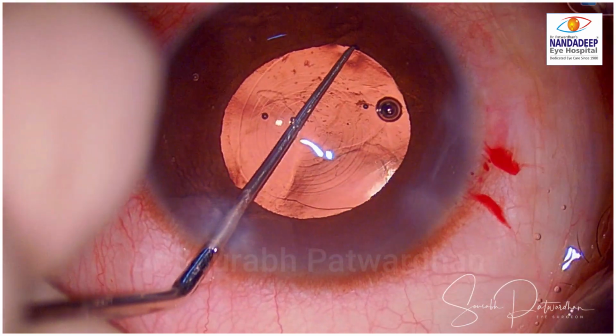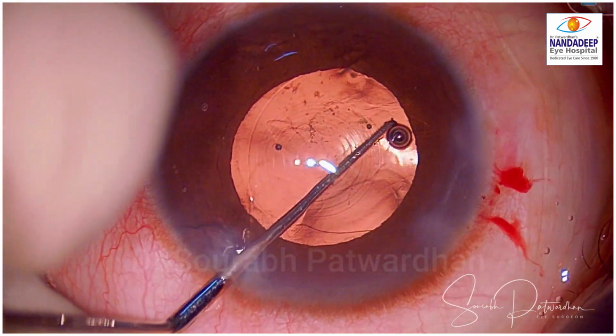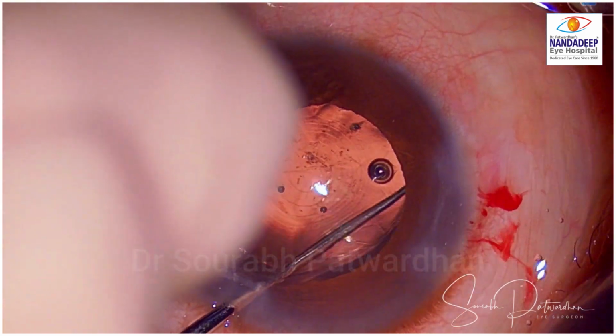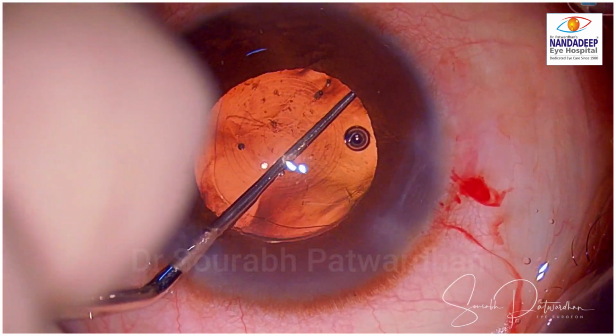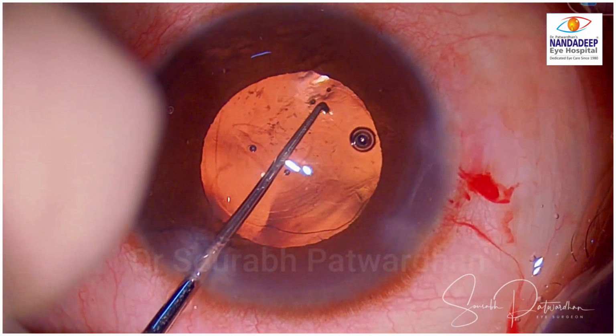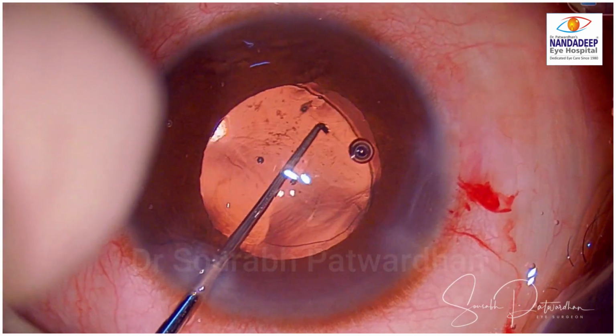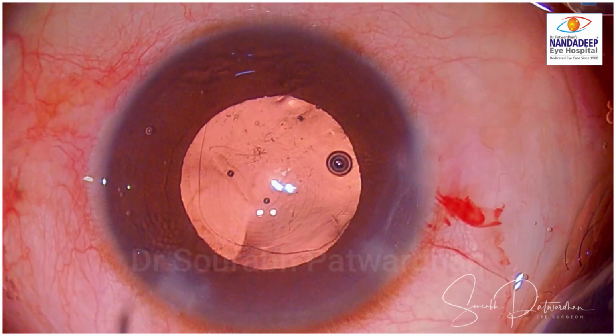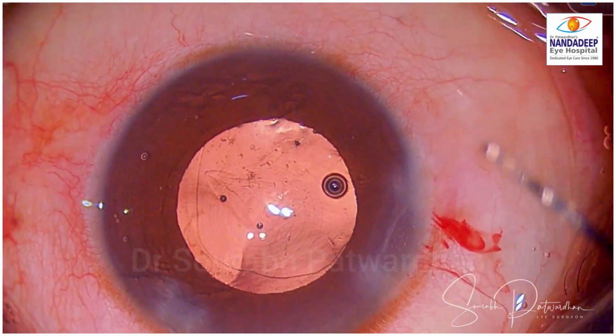I am looking for the CCC margin to understand the relation between the CCC margin and the IOL, whether the CCC margin is over the optic or not. So in such a case, how do you check? You have to dilate the pupil a little bit.